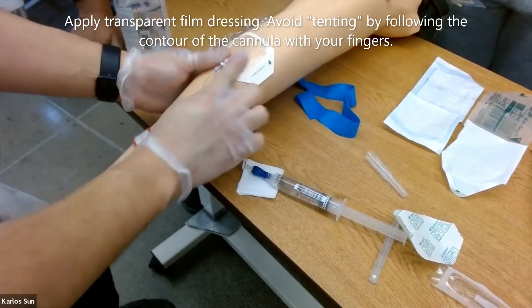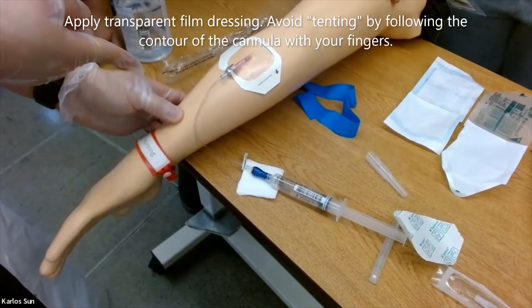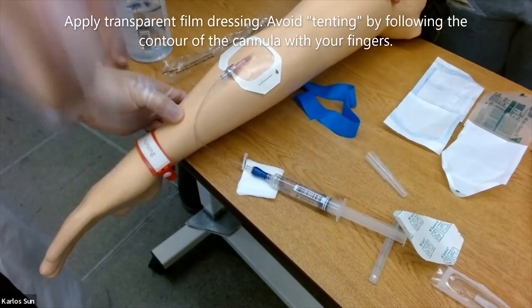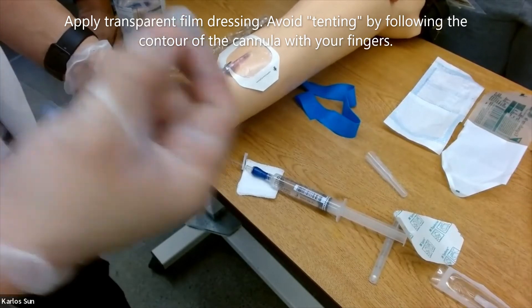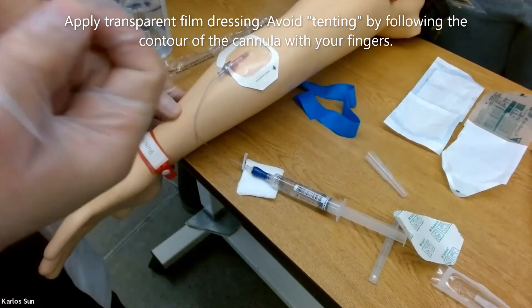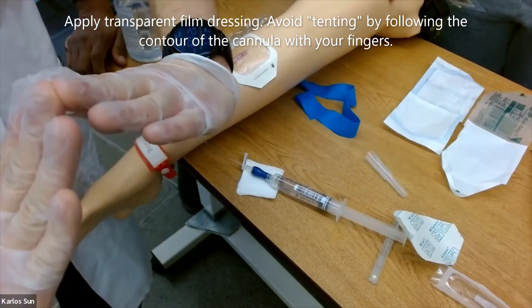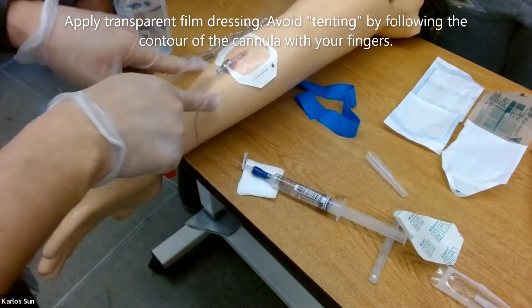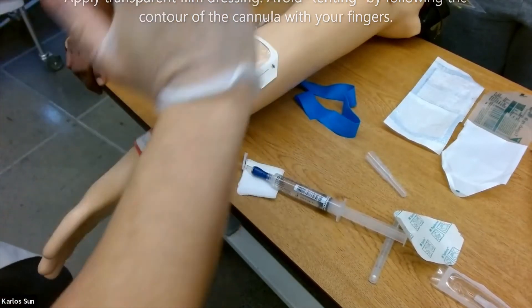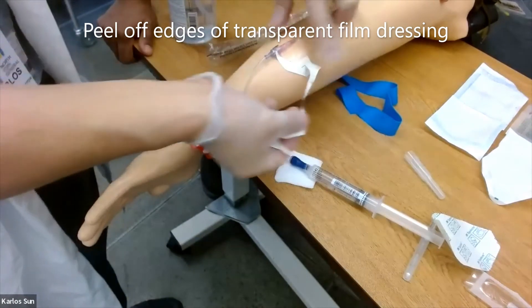Apply a transparent film dressing, avoiding tenting by following the contour of the cannula with your fingers. Then peel off the edges of the transparent film dressing.